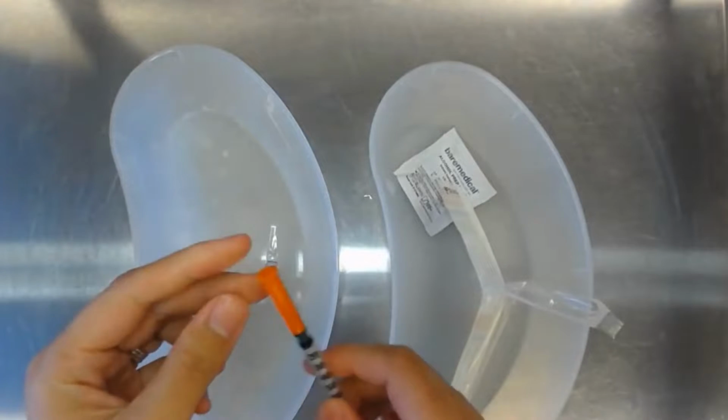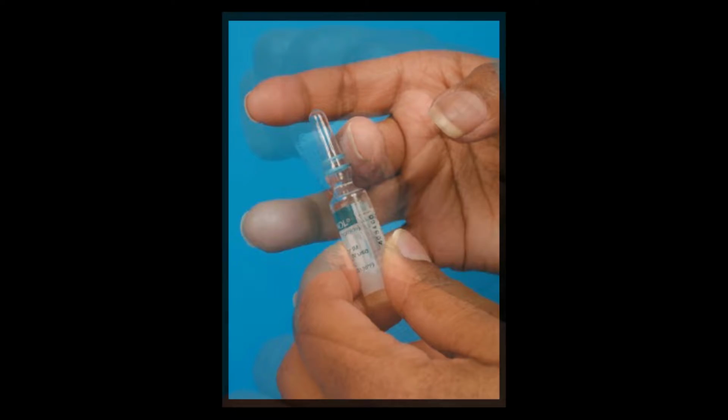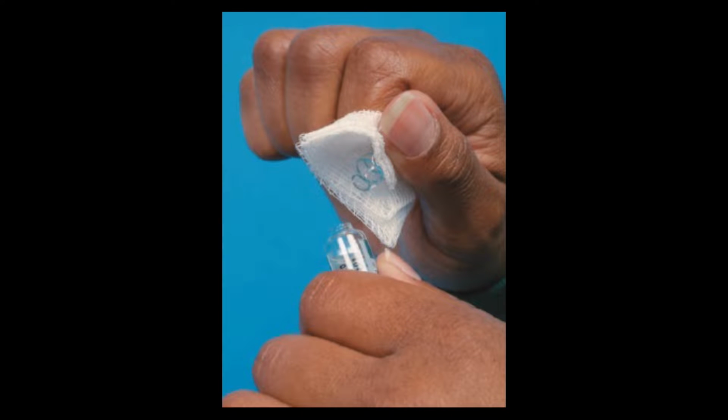Before you draw up the medication from the glass vial, tap the ampule to move the fluid down the neck. To protect the nurse's fingers from trauma as the glass tip is broken off, use a small gauze pad around the neck of the ampule, or I use the alcohol swab packet.